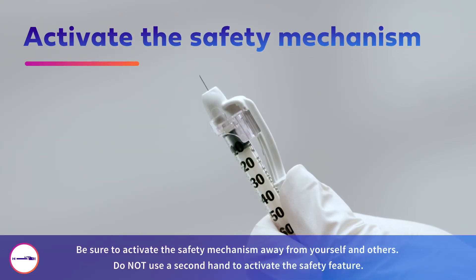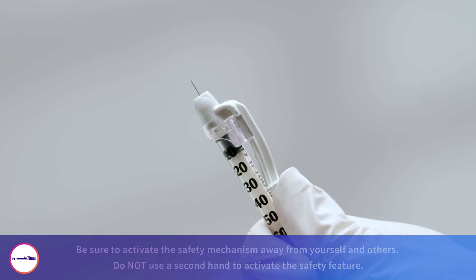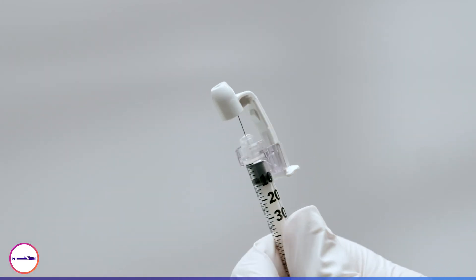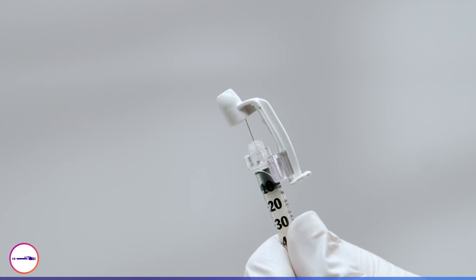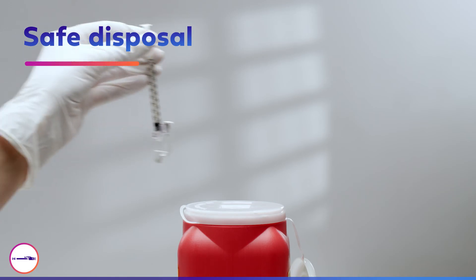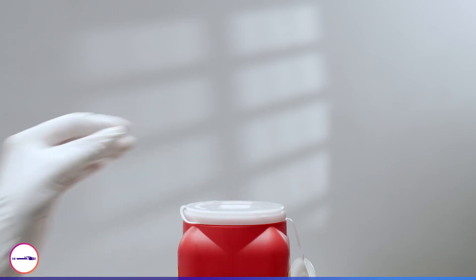After the injection is complete, immediately activate the safety mechanism by using a simple one-handed technique. Move the safety arm completely forward until it is fully extended and the needle tip is covered. You will hear a clicking sound when the safety mechanism is activated. Discard the used syringe in an approved sharps container in accordance with applicable regulations and institutional policy.